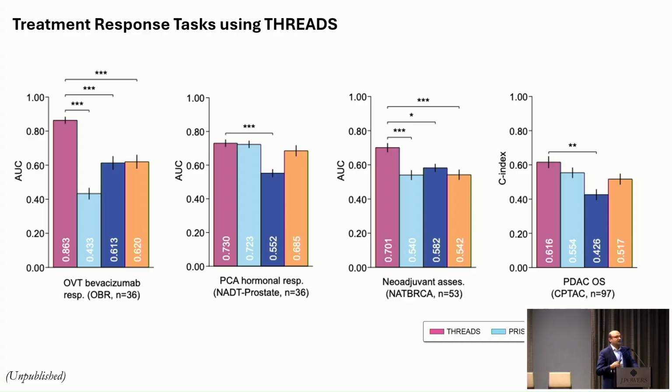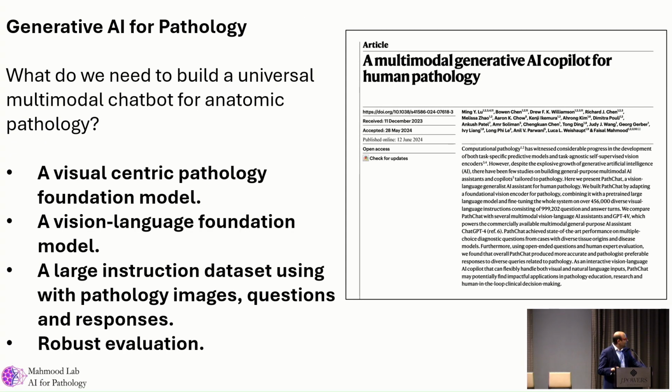In certain cases it could be easy, but these are some of the more difficult cases where we found that by using about 50,000 cases contrasted with histology in a pre-training setting, when you post-train it with this data, it works relatively well.